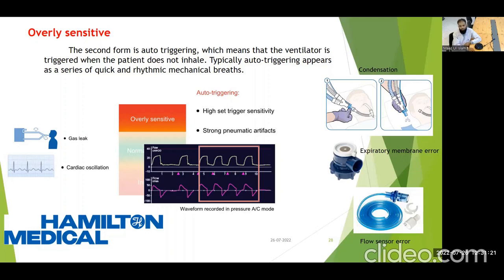The number three point is flow sensor error. This is the flow sensor used in the mechanical ventilator from Hamilton Medical. Sometimes some organizations use the flow sensor again and again. I want to say that the flow sensor is not a reusable product. It is a disposable product. The lifetime of a flow sensor is 28 days on a single patient.